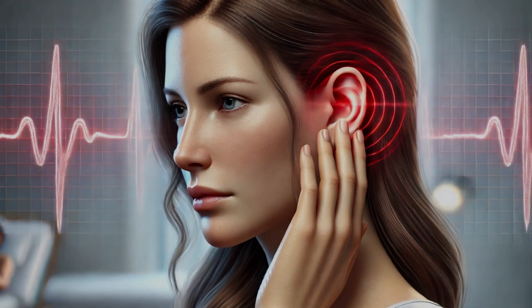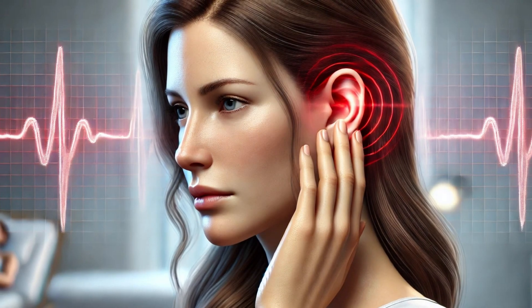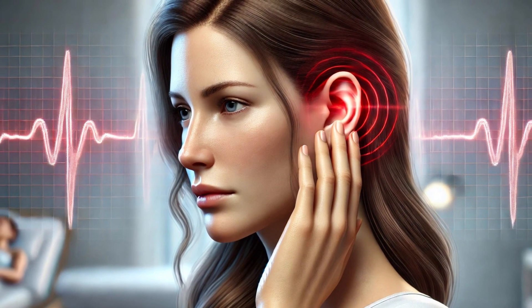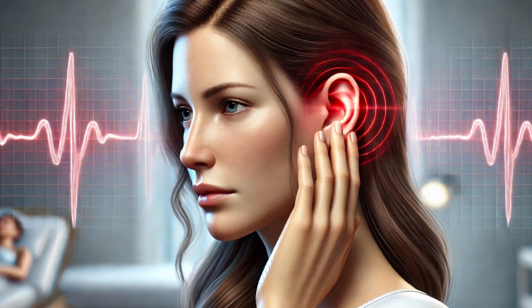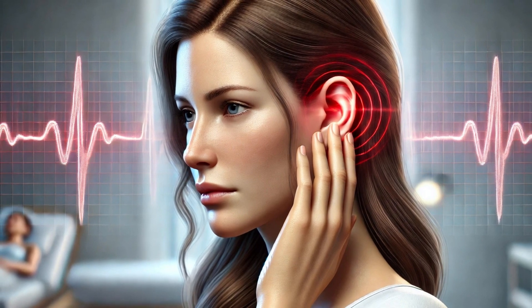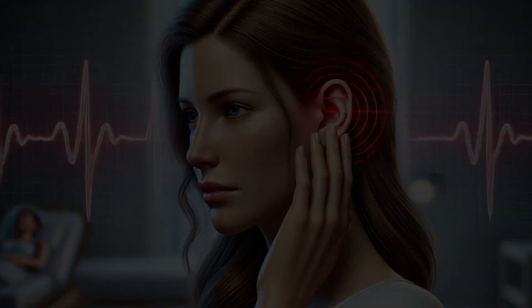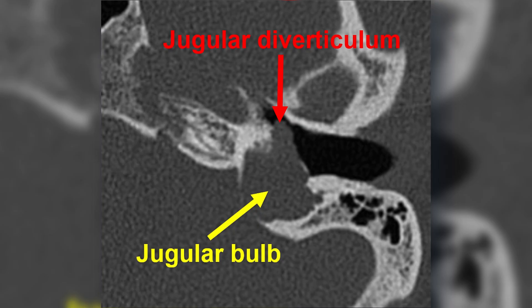A 39-year-old female patient with left pulsatile tinnitus. A computed tomography of the temporal bone was performed. On axial section in bone window of the left temporal bone, a high jugular bulb is identified, accompanied by a sac-like lesion protruding anteriorly into the middle ear cavity, a finding compatible with a jugular diverticulum.